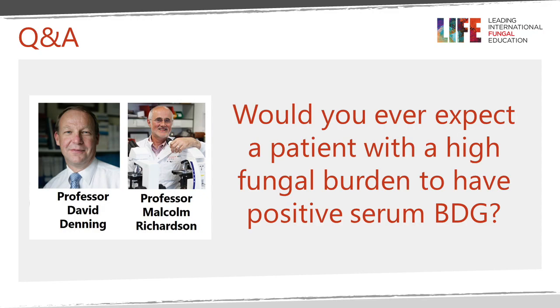Okay, another question. From your own experience and the experience of the National Aspergillosis Centre, is there any particular pattern within a CPA patient, for example with an aspergilloma, where there's quite a high, large fungal biomass, where you would expect the patient's serum to be positive for BDG? I don't know the answer to that question. My suspicion is no. We've done, and Malcolm, you know this, very few BDGs in these patients. In the number that we have done, they've always been negative.